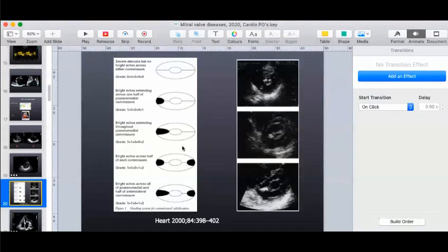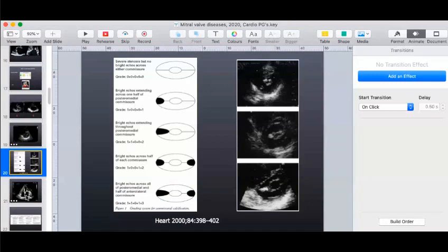This can be useful to you, not just for the examination, but also when you're doing your PTMCs, to find out whether you can go ahead with the ballooning. So this would be to look at the calcification.